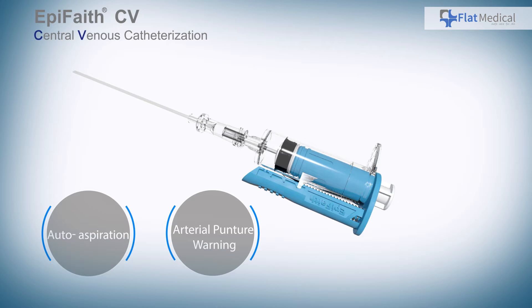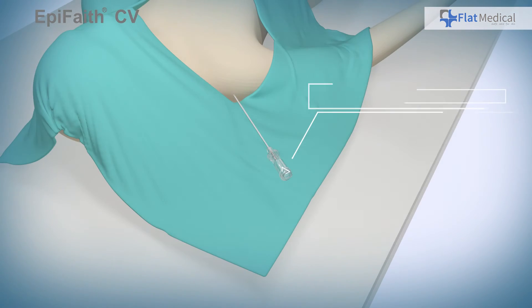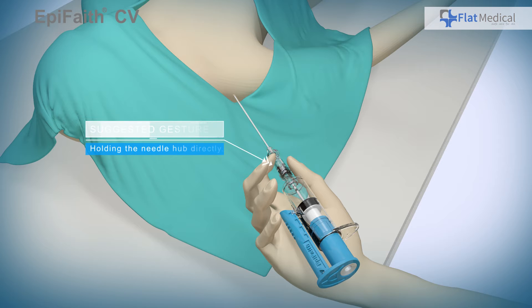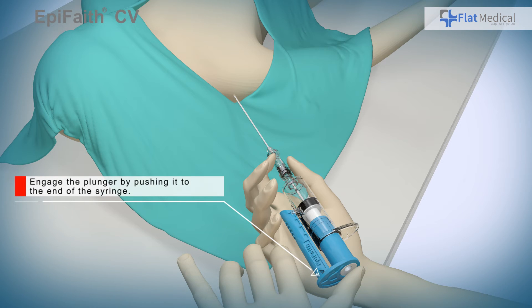To quickly detect an accidental insertion into an artery, the first step is to attach the EpiFaith to a puncture needle. We recommend that users hold the needle hub directly as shown in the demo video and allow the plunger to move freely in the barrel. Push the blue plunger in completely.